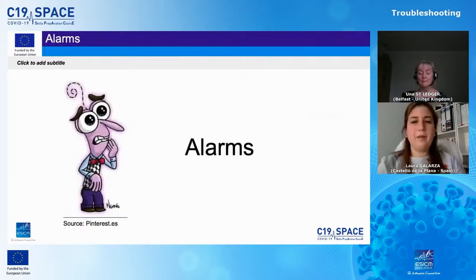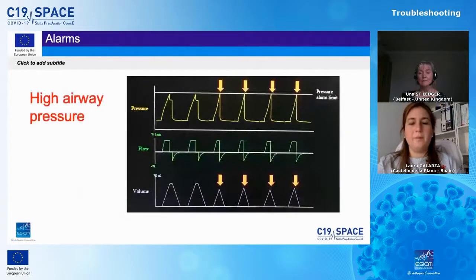So far, we have talked about checking the patient and bedside monitor alarms. So now we will review the most common ventilator alarms and what to do with them. These alarms can be seen in non-invasive and invasive ventilators. But don't be afraid, neither is scary. I'll try to make them as simple as possible.